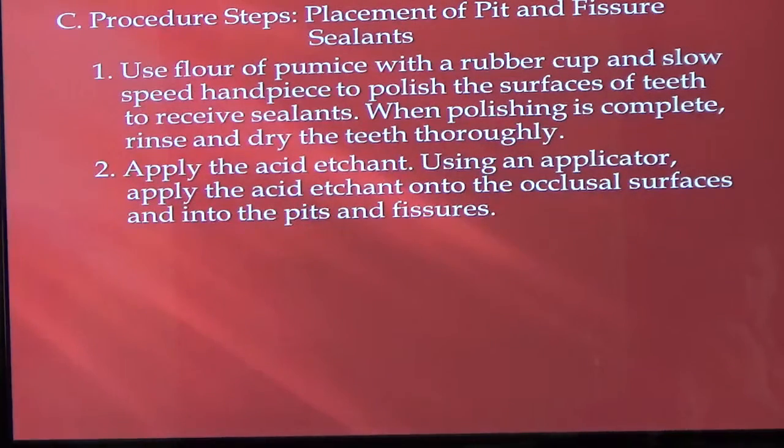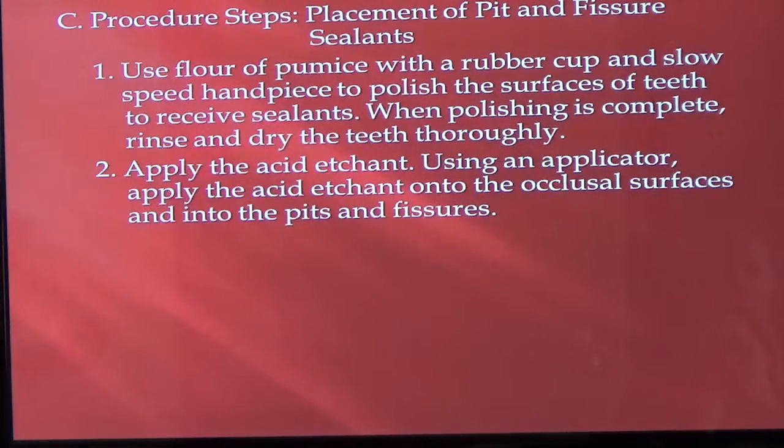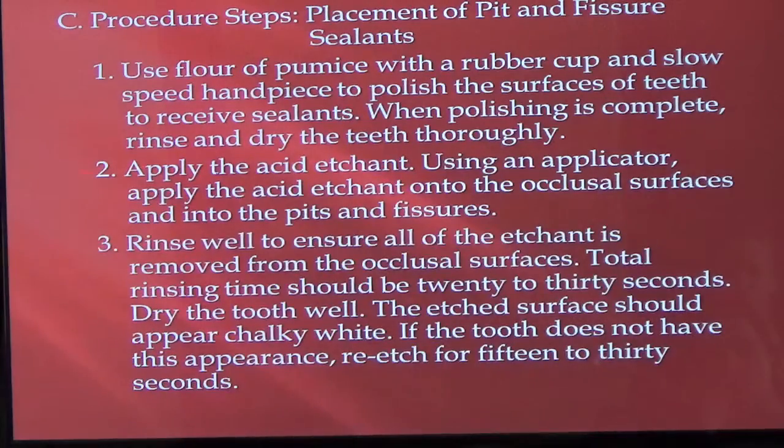The molars usually have a buccal pit. If you see it, you're going to etch the occlusal and etch that buccal pit. Once you etch it, rinse it, and you're going to see it turn frosty, and that's where you're going to put the sealant. Be sure to seal that buccal pit as well. Rinse the teeth well, 20 to 30 seconds. Dry the tooth. The etched surface should appear chalky or frosty. If the tooth does not have this, you've got to re-etch. On the mannequins, it probably won't do it as much.